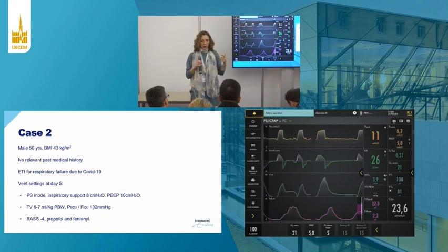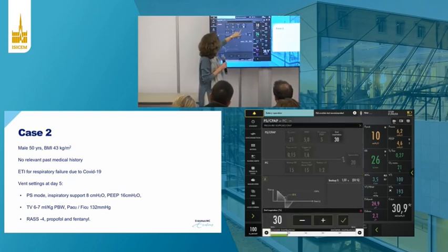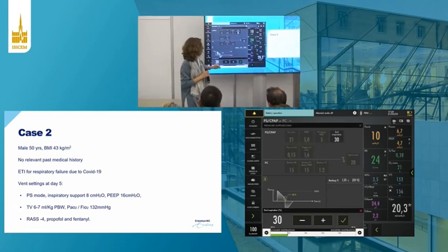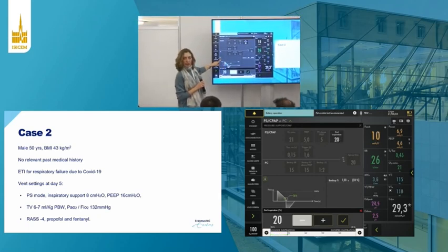If we want to prolong inspiratory time, we can increase the level of assist and decrease the cycling off criterion, which in this ventilator here is the percent of end inspiration, and this is a characteristic. So I'm going to change it and see how it moves towards the beginning or the end of the peak flow.